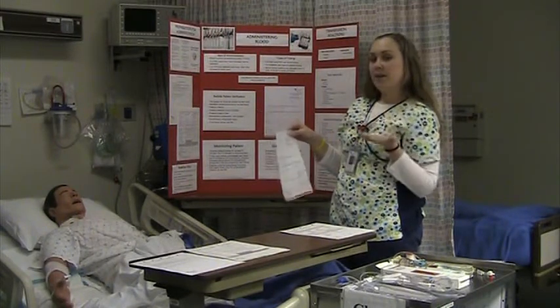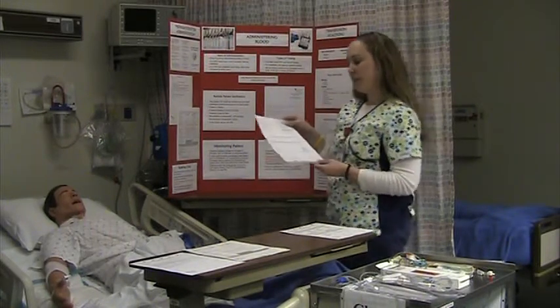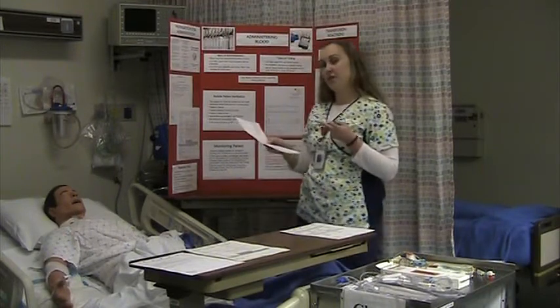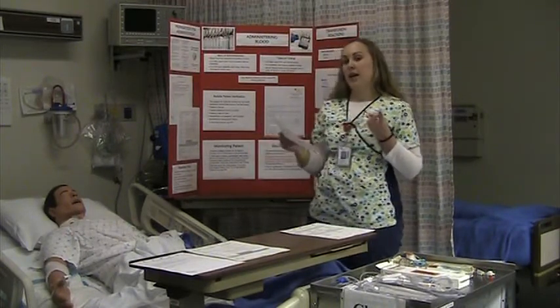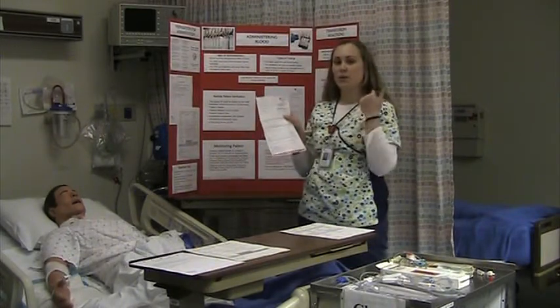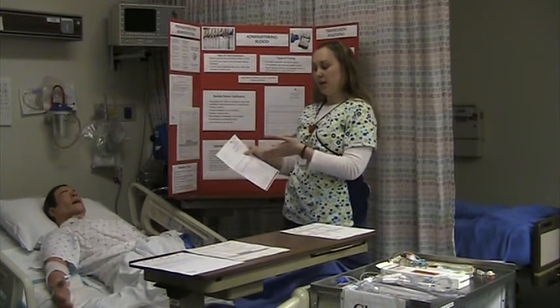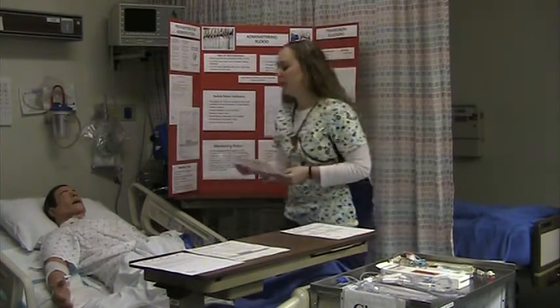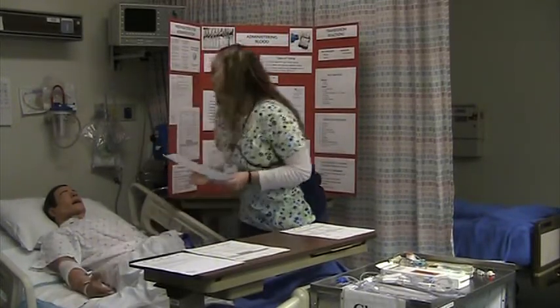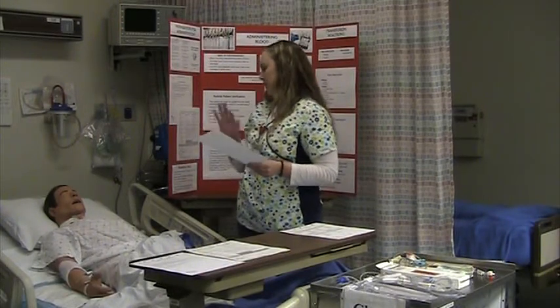Great. So you have your blood and you have your flow sheet, and you go back to your patient with another nurse. Two nurses have to be present to verify the blood. One person has the paper in hand, one person has the blood in hand, and you're both looking at the ID of the patient. So you say, hi, my name is Michelle, I'm your nurse today. I'm going to be giving you some blood. I know the doctor talked to you about this and we've signed the consent. We've gotten it all ready.